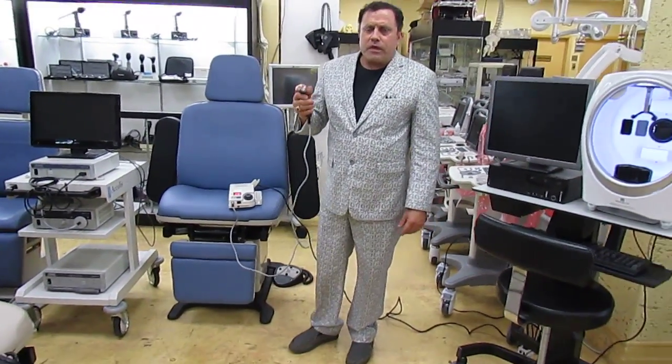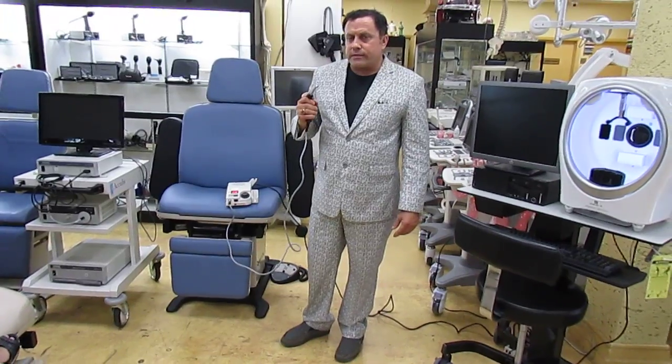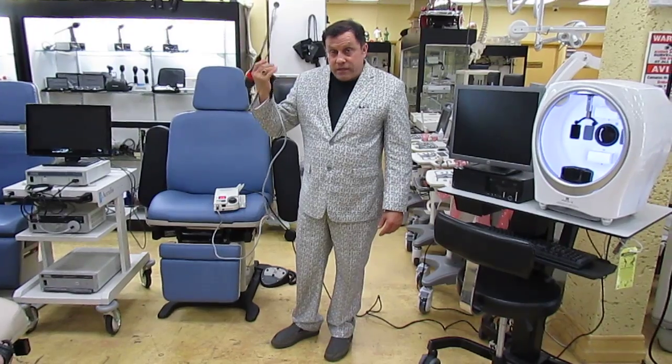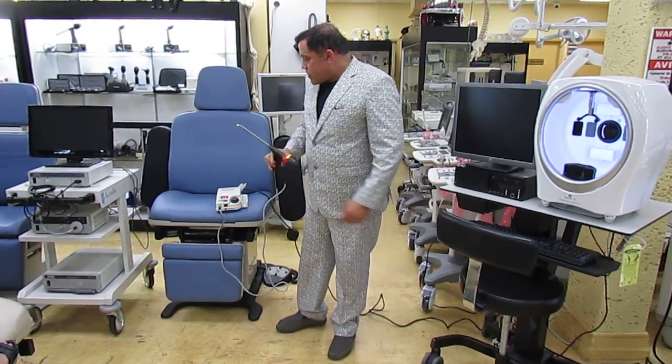The only other use I know of for this device is in hair transplant procedures — it stops minor bleeding at the scalp. It coagulates the tissue, so it's useful there as well.